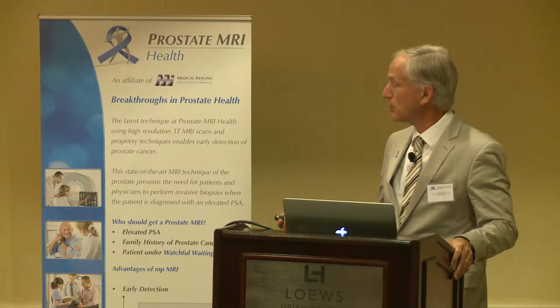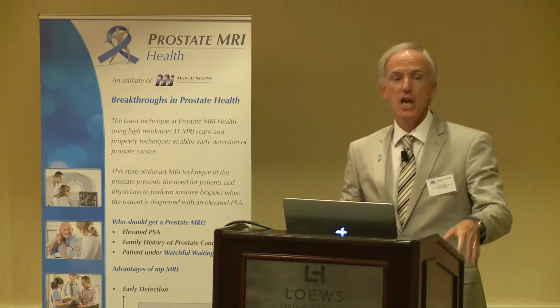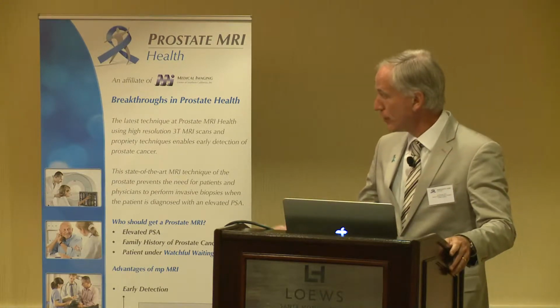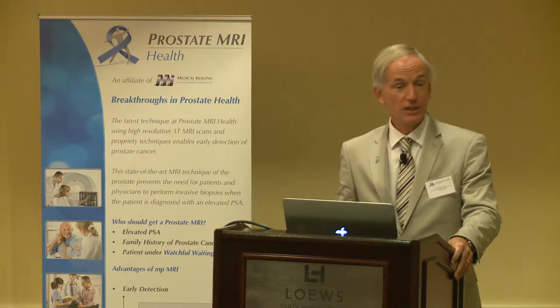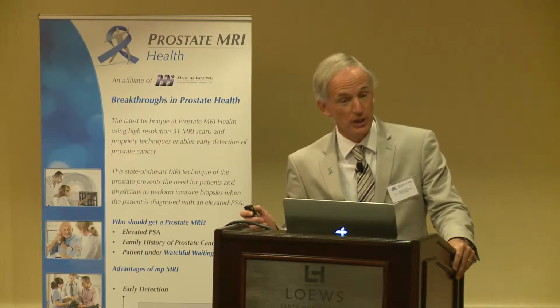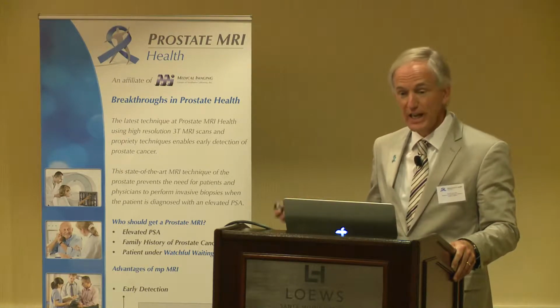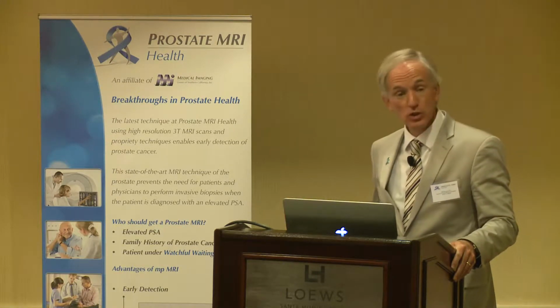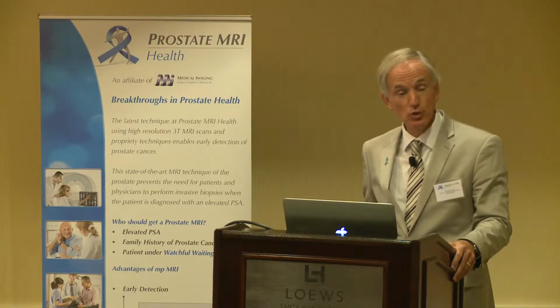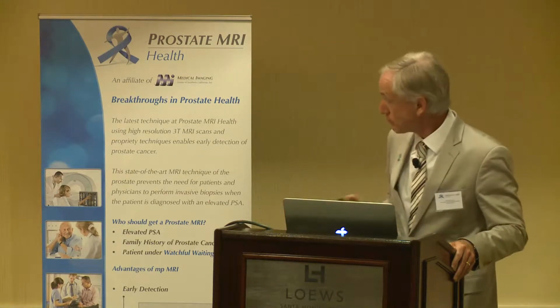Spectroscopy is not a BMW, it is for Ferrari drivers only. Why? It costs a lot of money, it is beautiful to do, it's a boy's dream, a radiologist's dream. However, you need experience on how to drive. This is what happens if you are a Romanian soccer player and you do not know how to drive a Ferrari. You have to buy a new one. Okay, experience. And that is what is lacking in common practice. So, spectroscopy is good. It's a very fast car, but you need to be a Formula 1 driver to get fast from A to B, and you don't need to have traffic jams, otherwise it won't work at all.